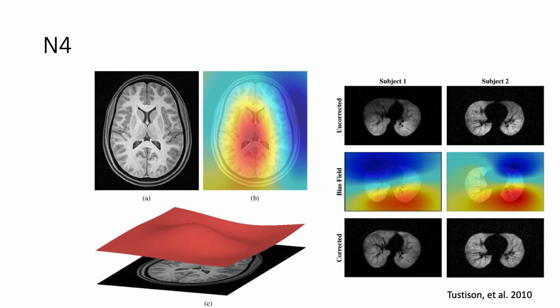and so it's really going to mess up your warp. Like I said, some of these, like AFNI in particular, I know because I've used it, they use that as part of their warping. They do that Unifize command, so that they can identify those different landmarks across multiple areas of the brain, so you can stretch and mold into the right gyri and sulci.